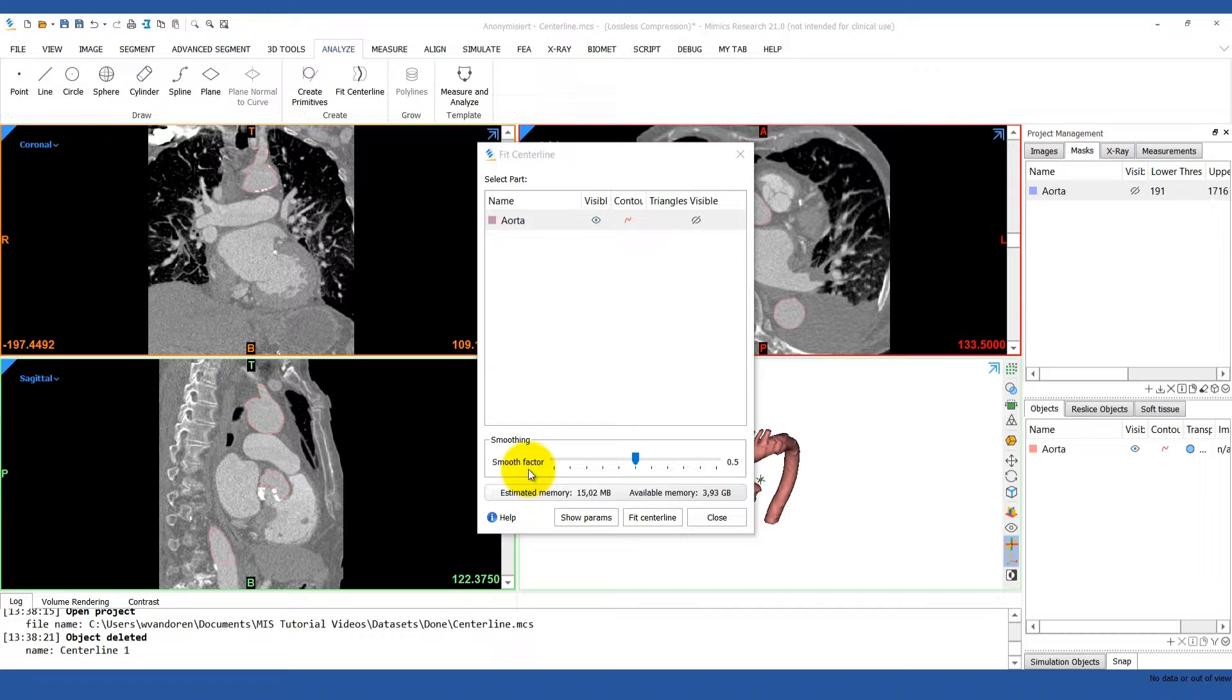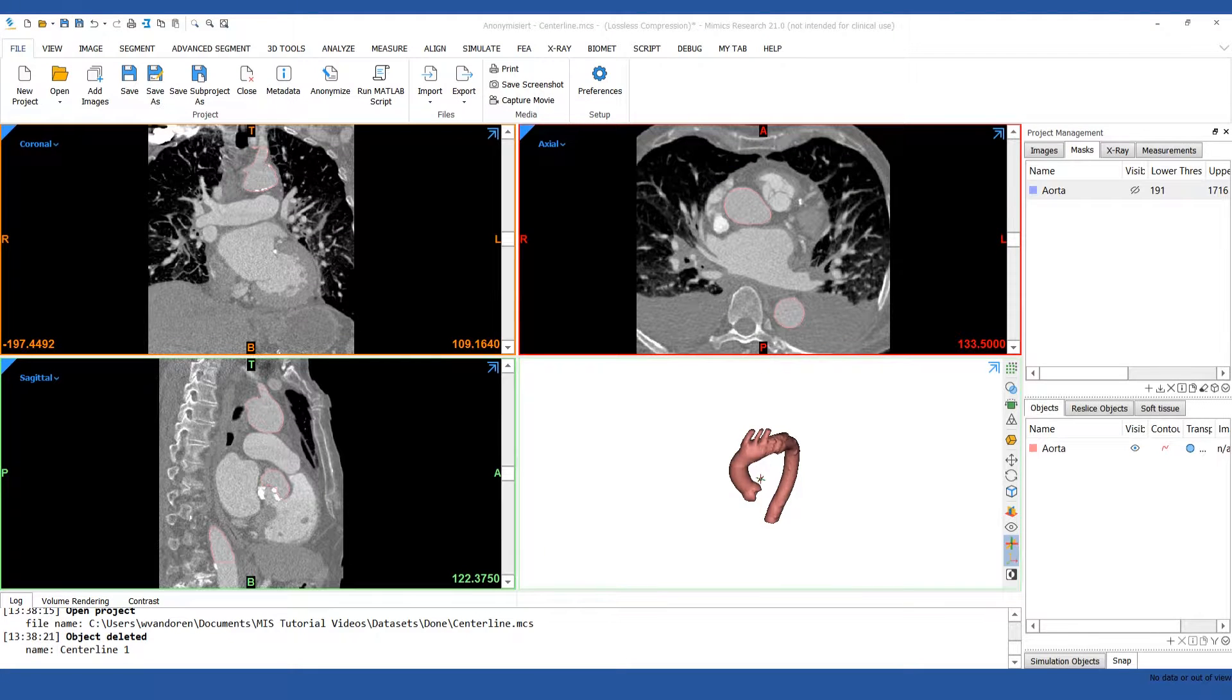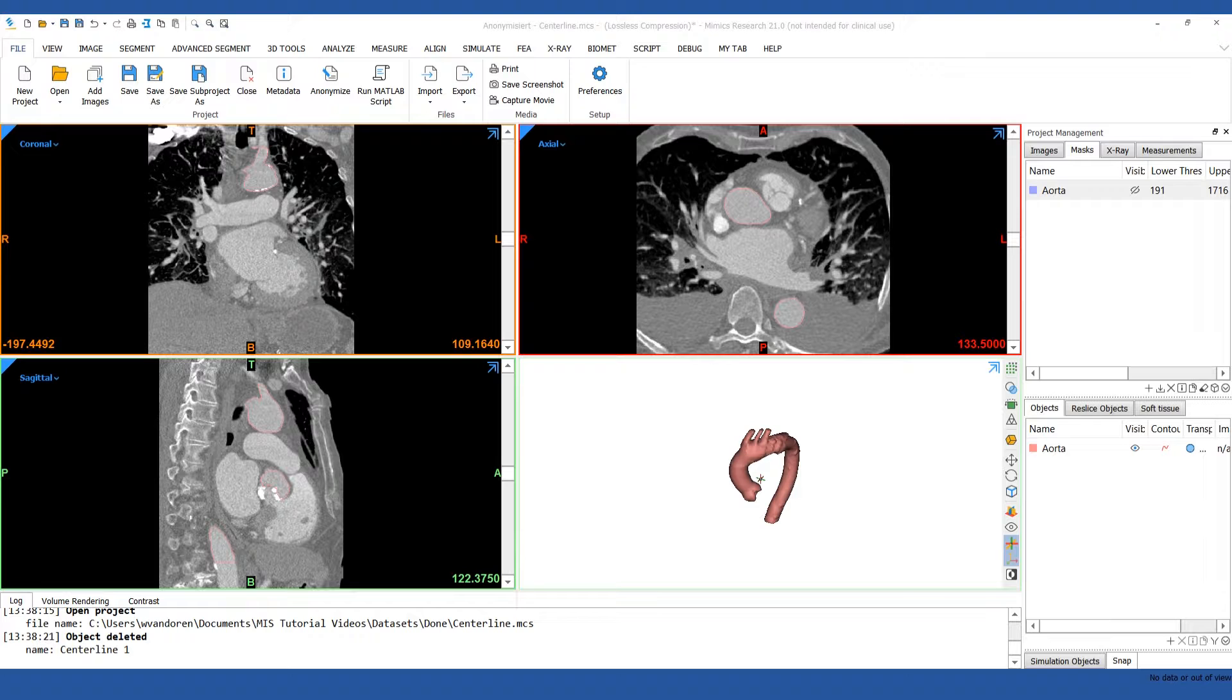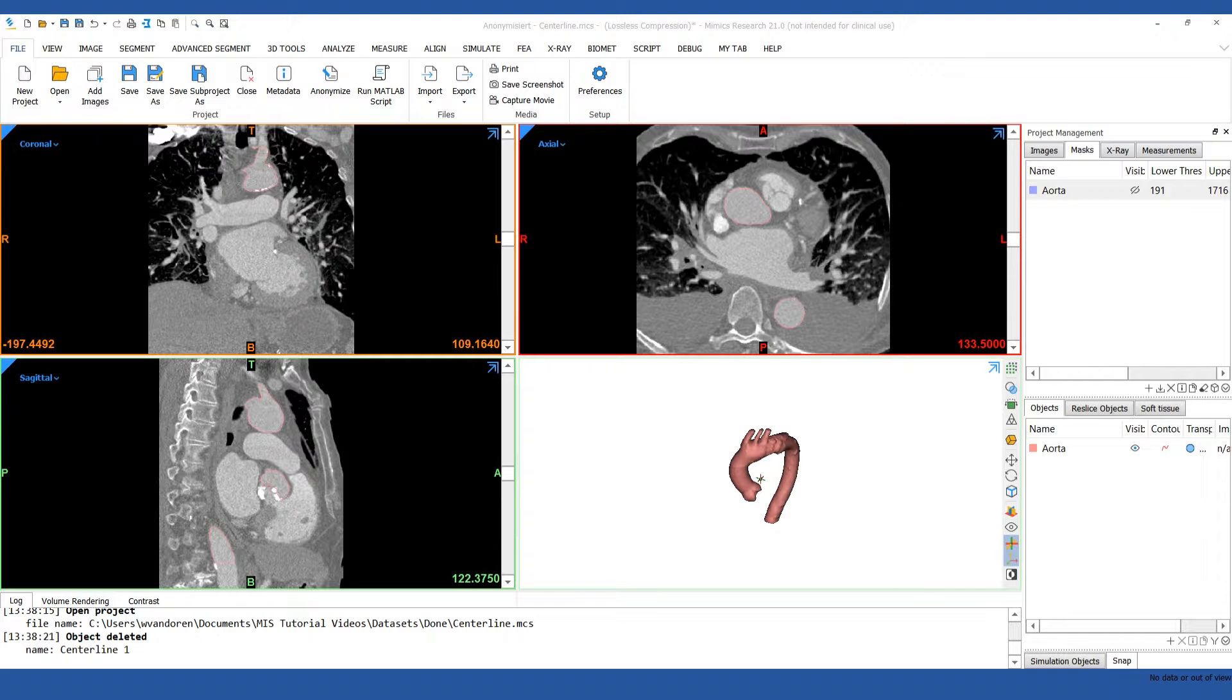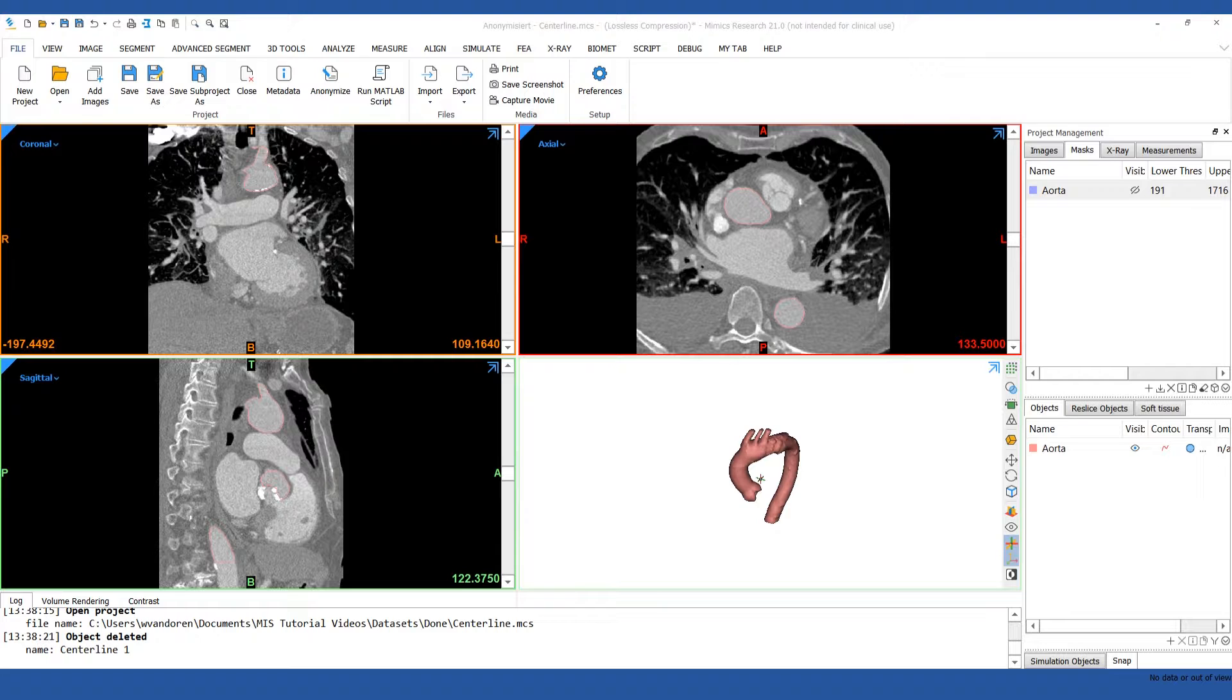Hello, I'm Inés and I'm an Application Engineering Team Leader at Materialize. In this video, I will show you how to analyze the centerline of the aorta. We're going to review the centerline tool in version 21 of the Mimics Innovation Suite. This tool allows you to calculate the center point along a tubular structure, take measurements of the anatomy, and then export these measurements as a text file. Typically, this tool is used for cardiovascular and pulmonary applications, but it can also be used for any anatomy with tubular morphology.